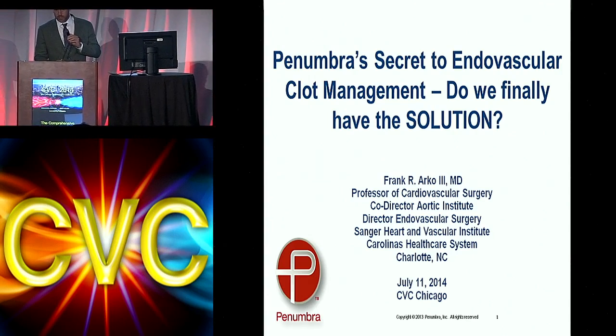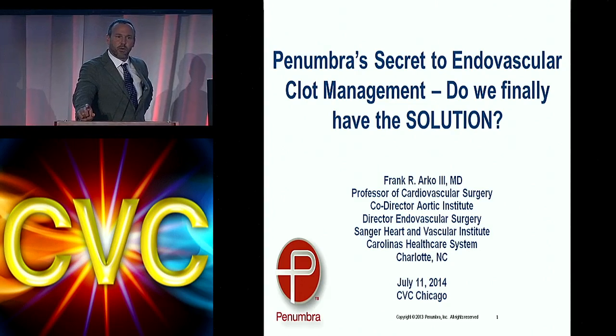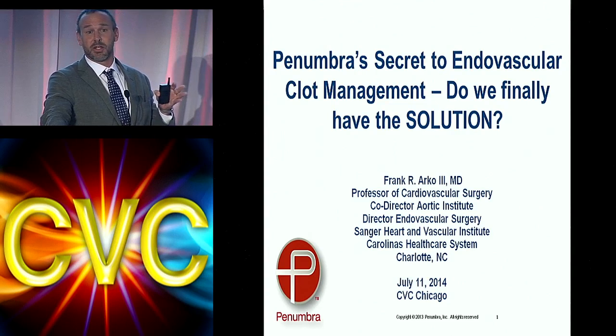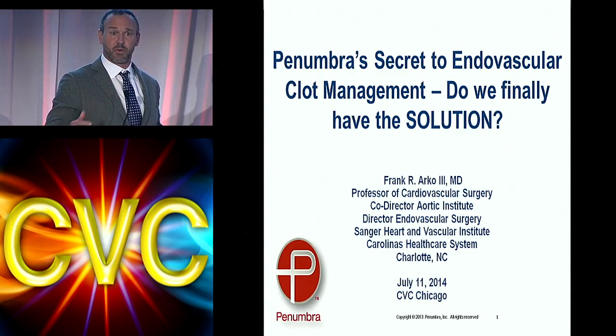That's actually a very good question. I'll speak to that a little bit. These devices are actually originally made for going all the way up in the cerebrovascular system and aspirating. So the very tips of them are extremely soft and really aren't going to do much damage. There is a taper, but it actually tapers backwards. So the lumen gets bigger, creating more suction.